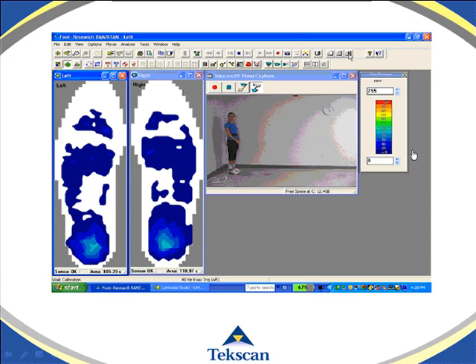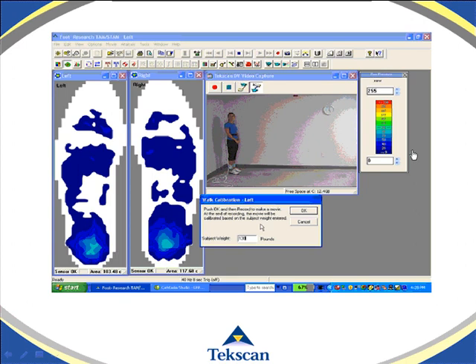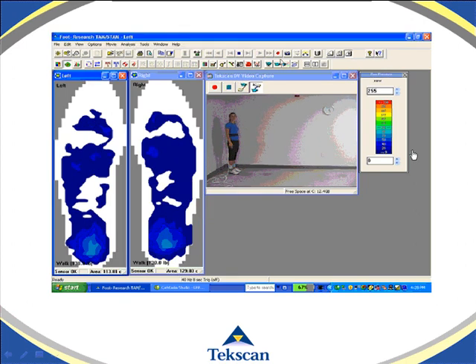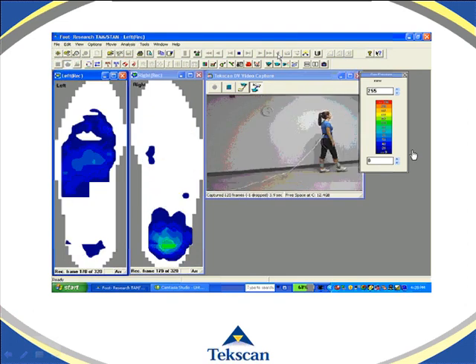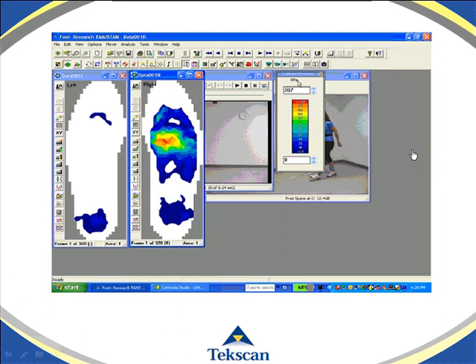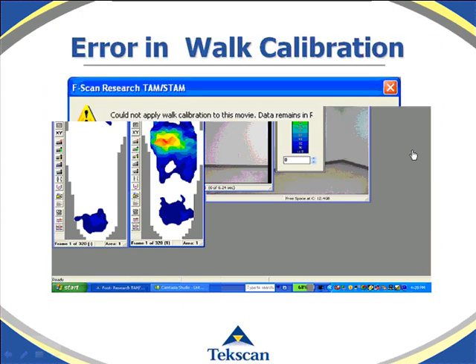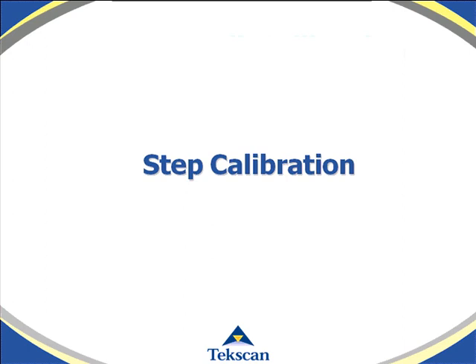To demonstrate walk calibration, you first click on the walk calibration icon and enter the subject's weight, then hit OK. Now it's armed to record and calibrate at the same time. Once you hit record, it's calibrating and recording. Once the subject's done recording, you'll notice that the color legend is now in engineering units. If the calibration isn't considered good, you'll get an error message saying the software could not apply the calibration to this movie. This safeguards you against poor calibration and ensures accurate and reliable data. The system will remain in raw units and you will have to recalibrate.